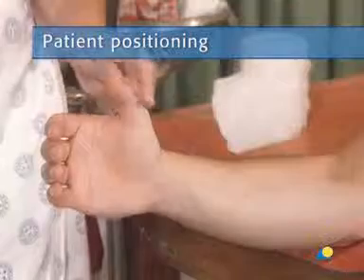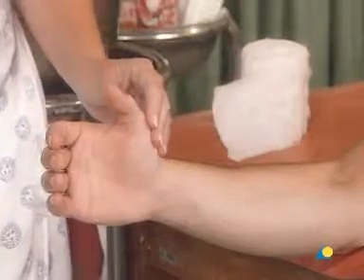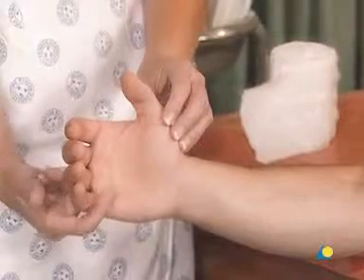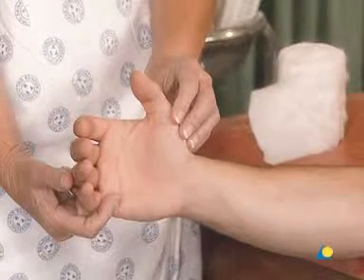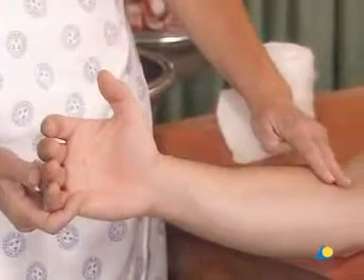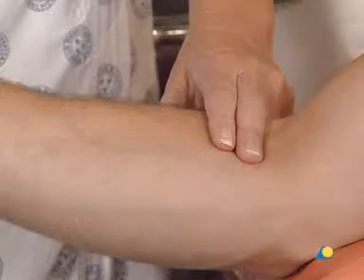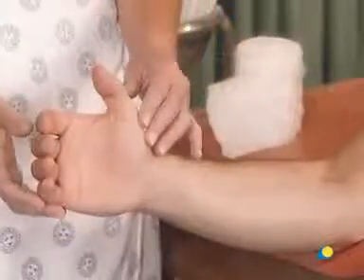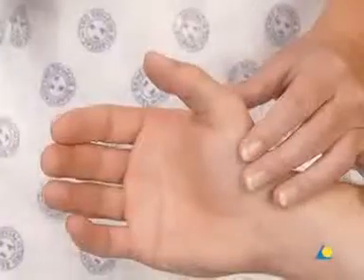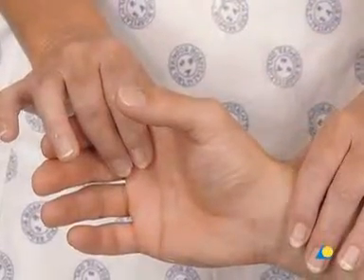The patient should be seated next to a table or trolley, with the elbow at the edge of the table to allow full access to the forearm and wrist. The distal border is located no lower than the distal palmar crease, so that the patient is still able to flex the MP joints to 90 degrees. The proximal border lies about two fingers distal to the crease of the elbow to allow continued flexion. The thumb, up to the nail, is included in the cast. The patient's hand is positioned as if holding a glass, giving a slight dorsal flexion of the wrist.